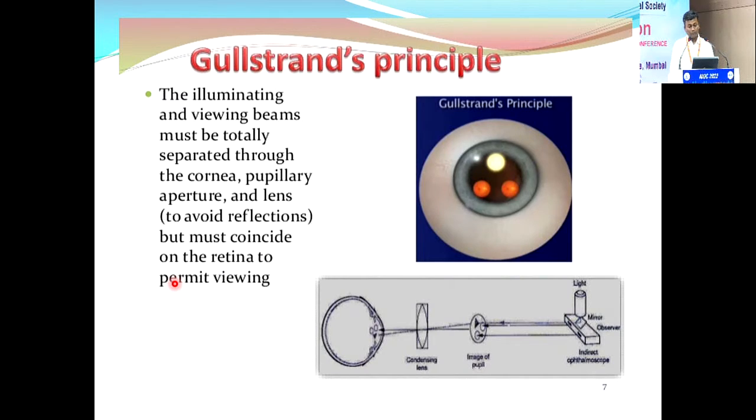Now coming to the very important principle, Gullstrand's principle. This is very important to get a good view. This principle says that the viewing beam and the illuminating beam should be separate.